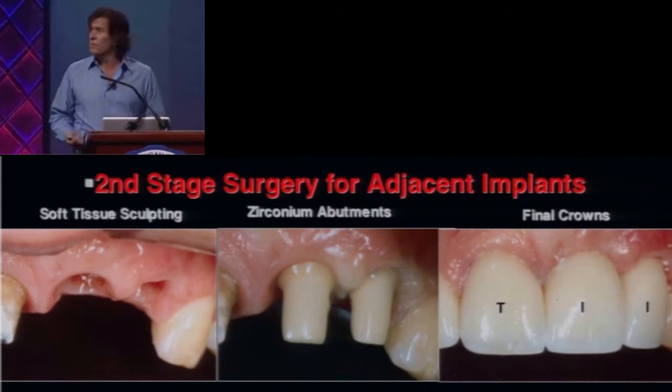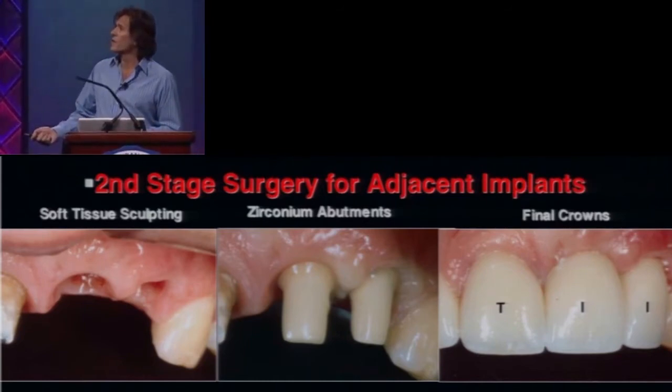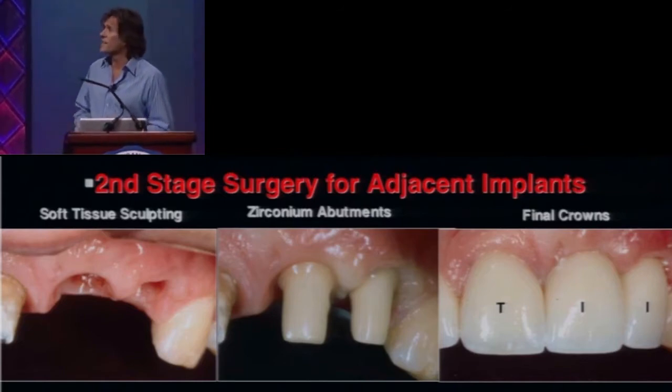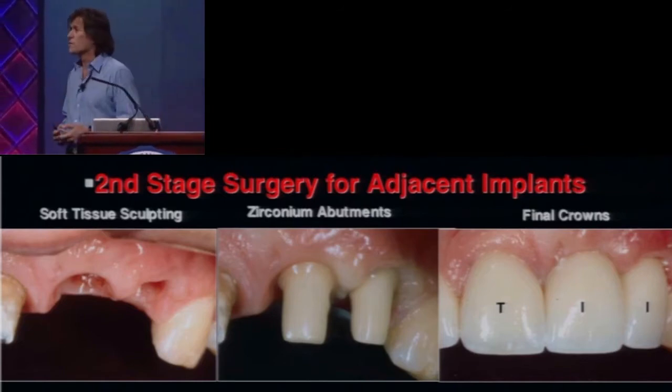But once again, the limitation when we have two implants next to each other is that you are slightly at a lower level interproximally, and that's just an anatomic consideration that we must appreciate.